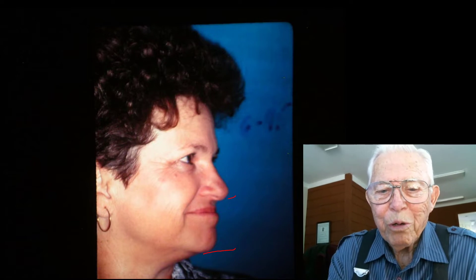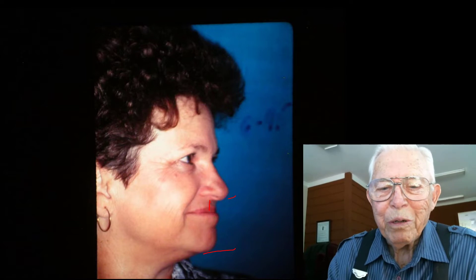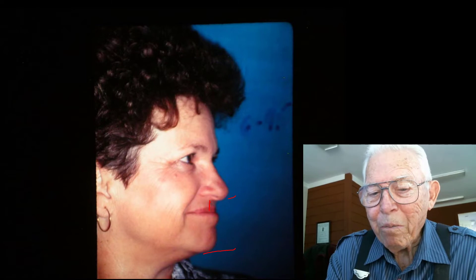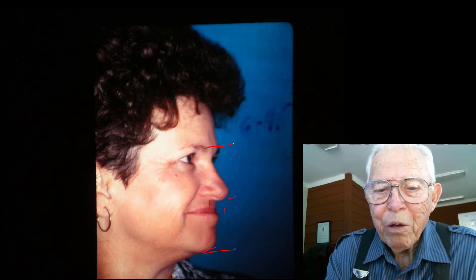This is the lady, and you can tell right away that the vertical height of the lower face is just too low right here. The upper lip is quite short and the chin is just too close to the nose. Of course she doesn't have a great deal of space up here either, but we're going to try to build this up and give her a little more upper lip space — you can kind of see how we tried to do this.